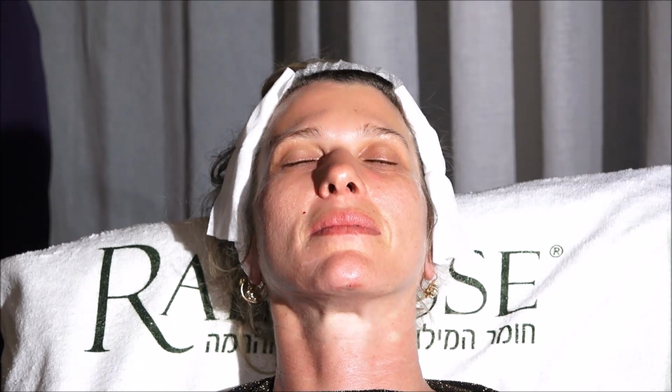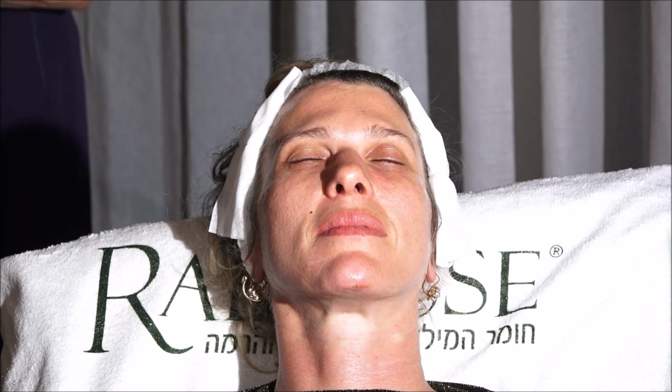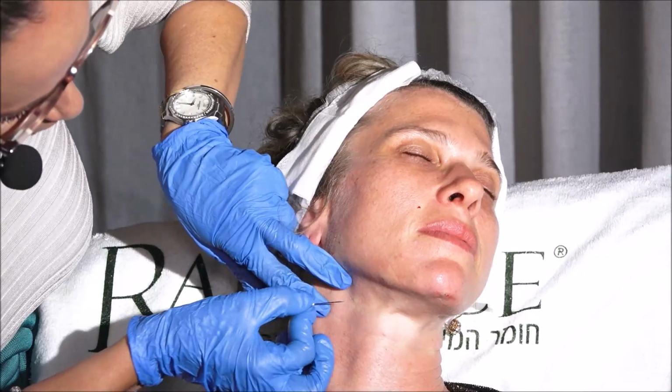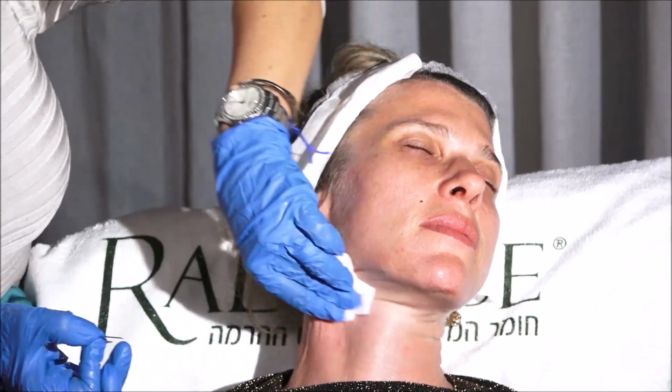And now the balance. So there's some tips and tricks. Well, balance, no. No, I want the neck. No, I want the balance with the needle. We can do the neck. We can do the neck. The Revive, this is the loop. Yes, but the balance for the... Look, here I put 1 point of entrance for the neck for you to see how I inject the neck. I also use a 1-to-1 dilution of Radiesse. No, it's this one. This one.